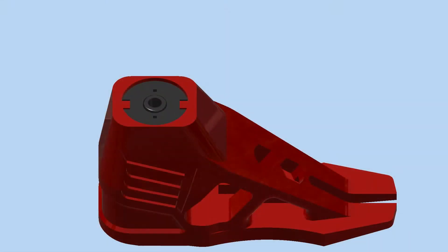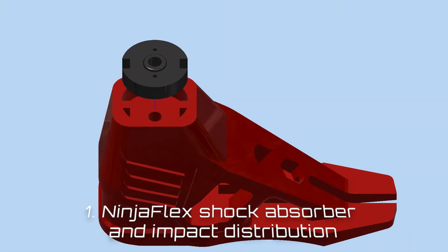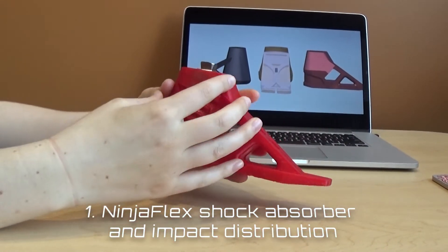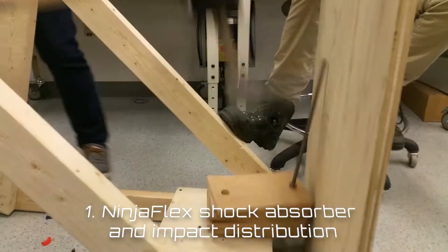First, a shock-absorbing insert under the pylon provides added cushion, while the conical or pyramidal shape of the heel disperses forces of the initial impact.